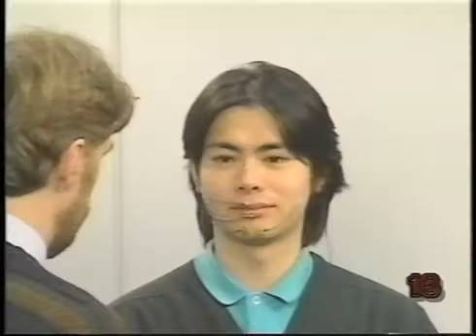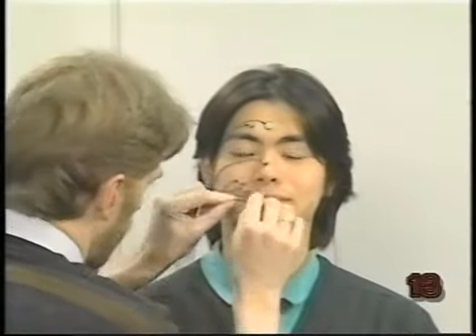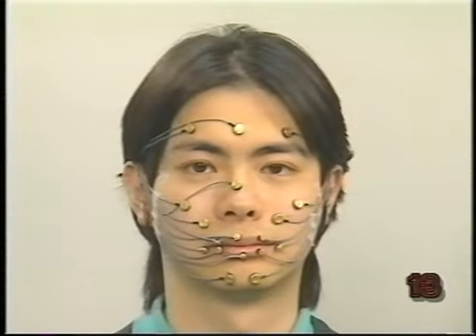Since the OptiTrack measures 3D position of as many markers as we like, we can put them wherever we want, as shown in this next setup, which we are using to examine facial contour and motion during speech. Data acquisition is controlled from the PC, which stores the marker data in a separate file for each trial.